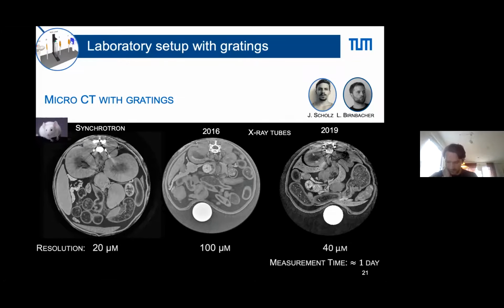And if you go for a phase grating alone without any analyzer or a coherent source, then you can overcome these difficulties that your gratings are transparent.